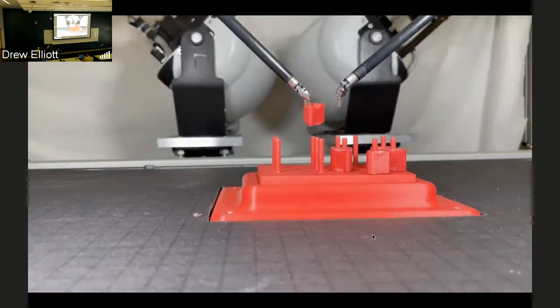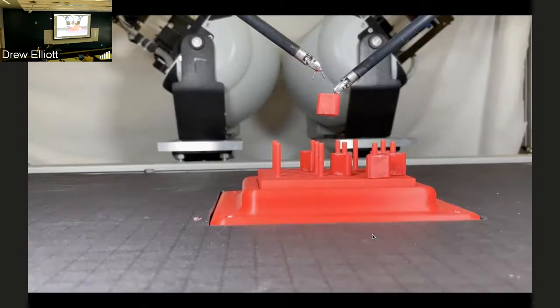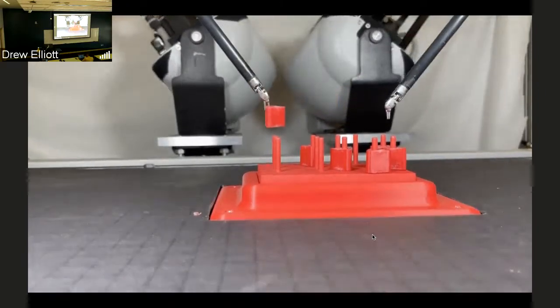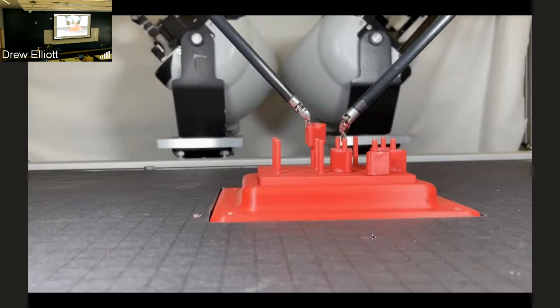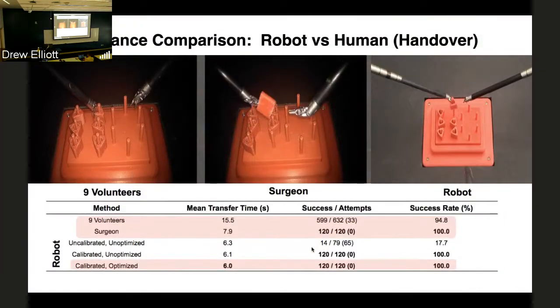The last thing we've looked at here is actually the handoff. And this is particularly challenging because now you're depending on the accuracy of both grippers, the precision of both tools, because you have to perform this handoff. So we didn't have high hopes for this, but it was actually very successful.